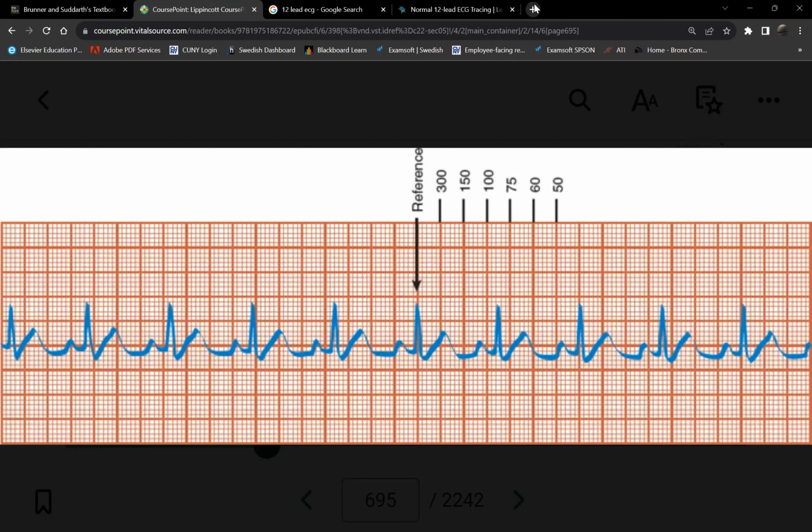However, do not worry, because if it's an irregular rhythm, will the heart rate be the same from 1 minute to the next minute? It won't be the same anyway, correct? So it's still going to be an estimate. Are we clear? However, don't worry, as long as you have working equipment, the monitor machine will give you an estimated heart rate. Okay, you don't have to count it.